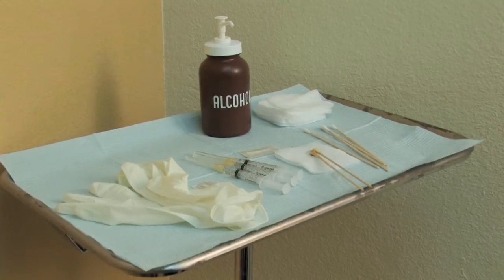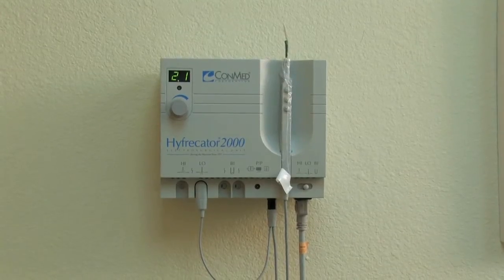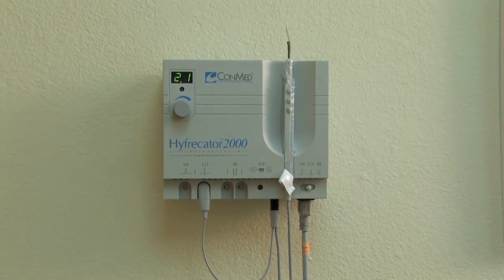The materials I'll be using to remove Nora's facial moles today include a local anesthetic, a gauze, a blade, a solution containing iron to stop the bleeding, as well as a cauterizing machine called a hyfrecator. The first thing I'm going to do is do a sketch for her on what the mole is and how the procedure goes.